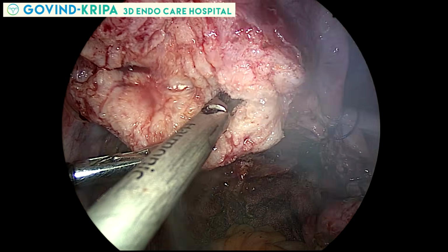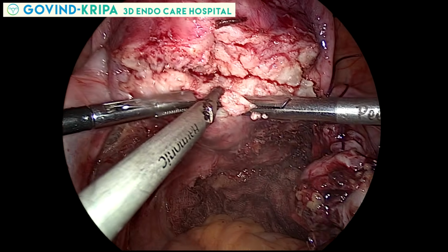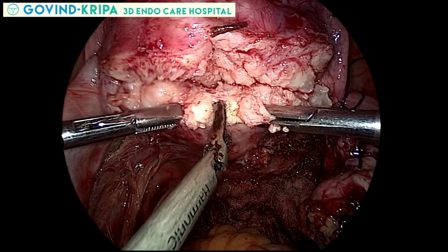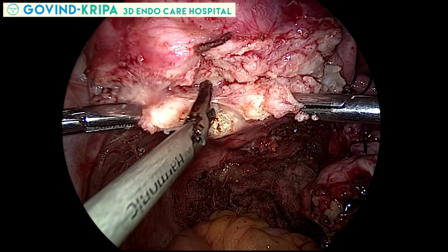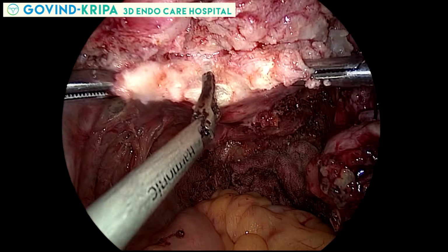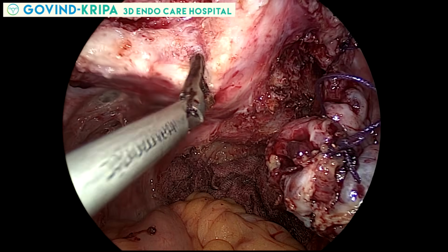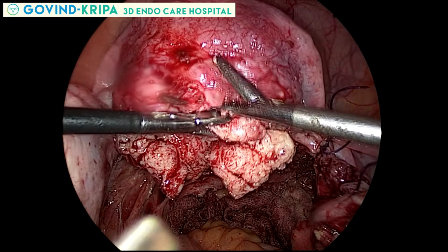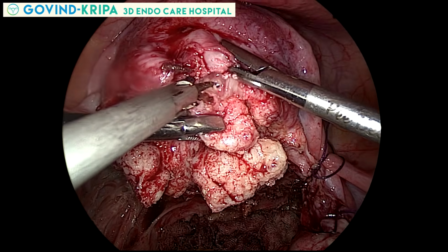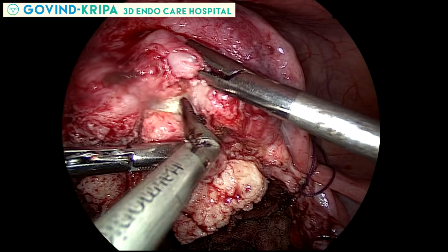One can appreciate the hardness in the consistency. Then the vertical incision is taken. So basically the posterior wall of the uterus is opened in three flaps, and with this exposure adenomyotic tissue is cut excised from the core with the harmonic.